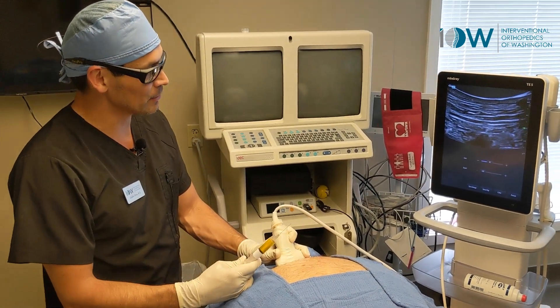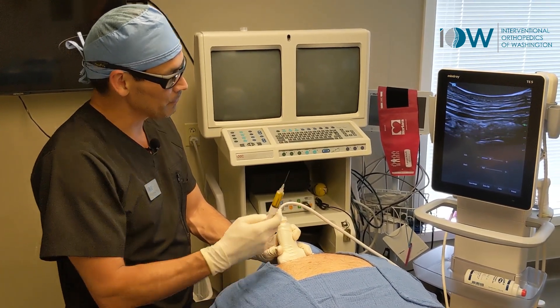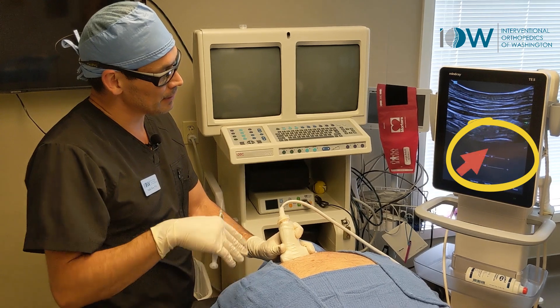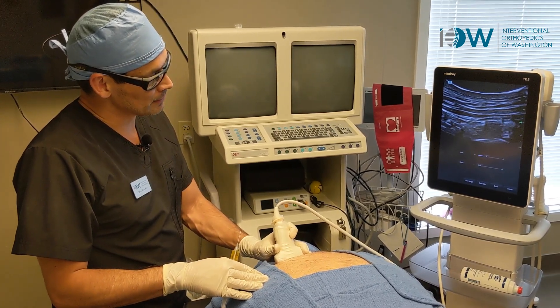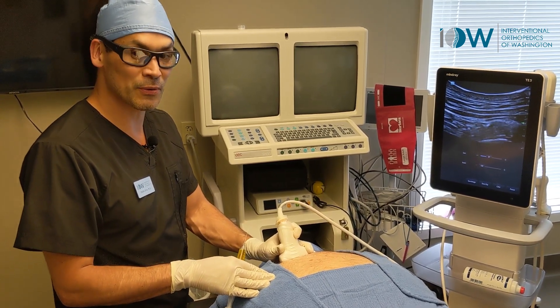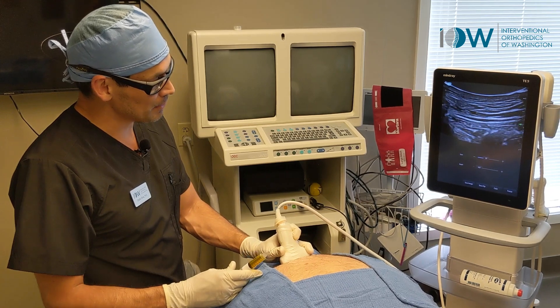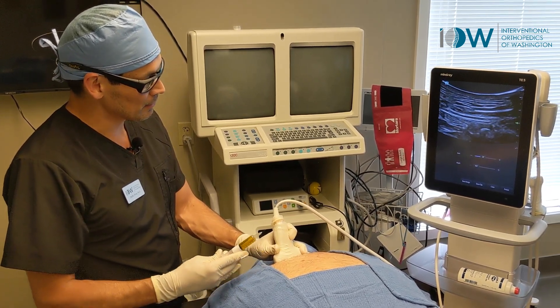It's important to be doing this under ultrasound, because if I just slide slightly below it, you can see that is the lung — as it kind of moves, that's the air fluctuating in and out of his lungs. That's certainly nowhere we want to be with a needle, because we can cause a pneumothorax. So find a doctor who does this under ultrasound, and you can be safe and sure that you're getting a correct injection right into your joints.